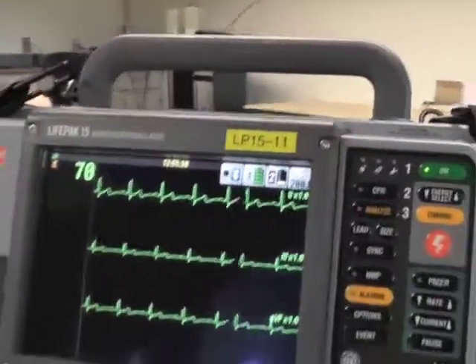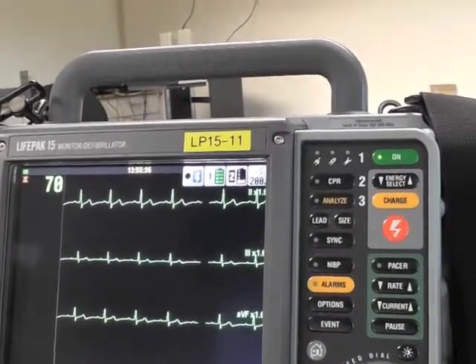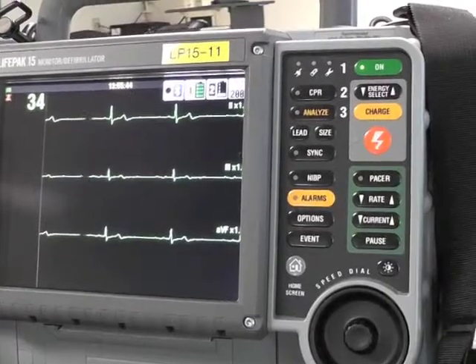So one of my H's could be hypoxia. We're going to fix that by bagging the patient and also by monitoring capnography to make sure to keep our CO2 between 35 and 45. Okay. All right. So 2 minutes are up now. Time for a rhythm check, and we evaluate the rhythm, and the rhythm switches to this rhythm. So this is sinus bradycardia.